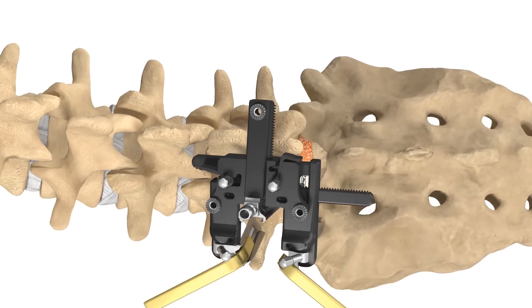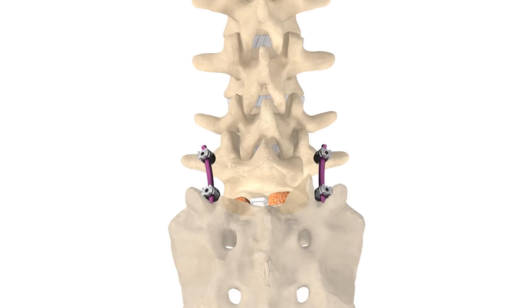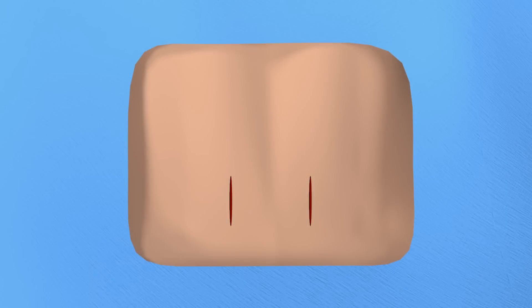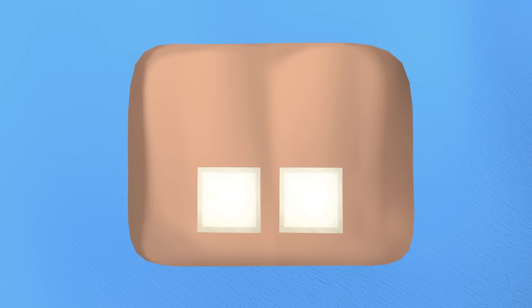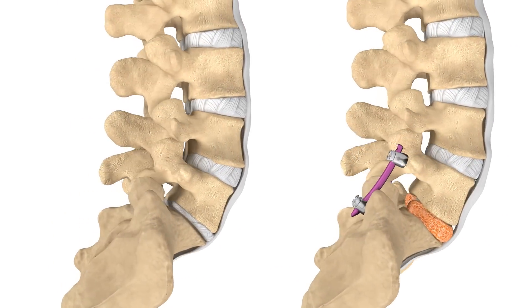In order to stabilize the spine, the screws will be connected with a rod. This stabilization will encourage bone to grow and fuse the vertebrae together.